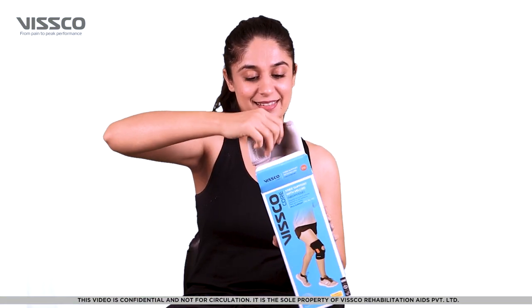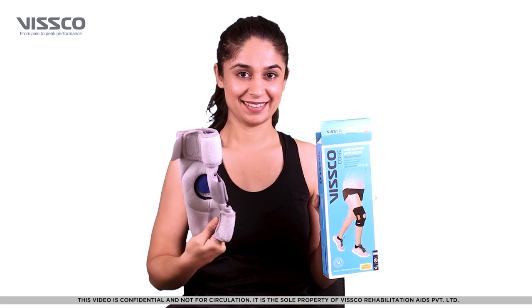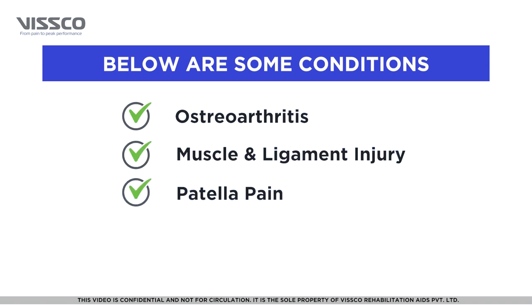The VSCO Neoprene Knee Support helps to support weak knee muscles and relieve knee pain. It is used in case of osteoarthritis, muscle and ligament injury, and patellar pain.